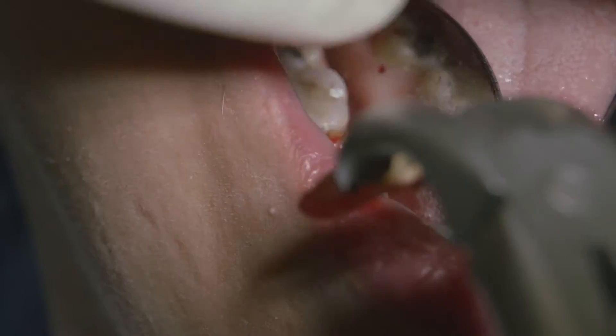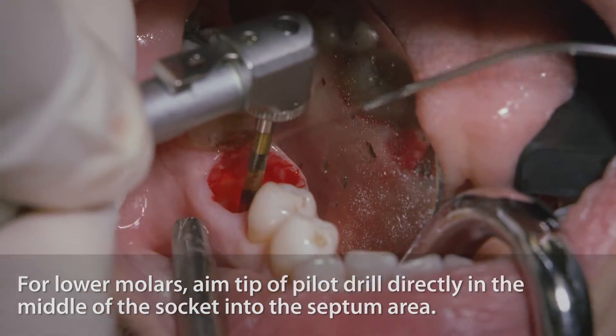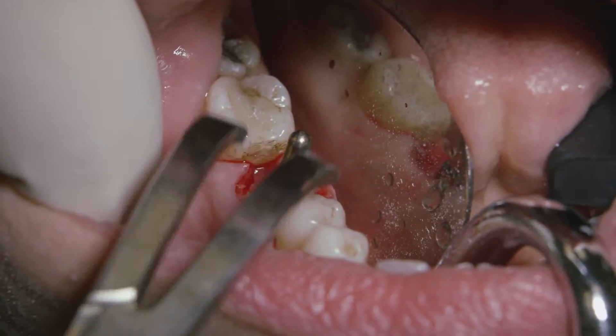For lower molars, we usually recommend aiming the pilot drill — the tip of the pilot drill — directly into the septum area, right on the center of the socket. The idea is to establish the proper direction and depth of the osteotomy.